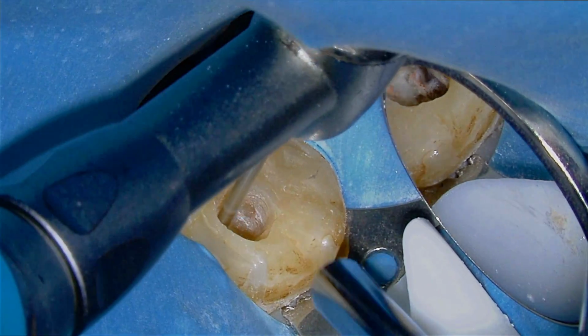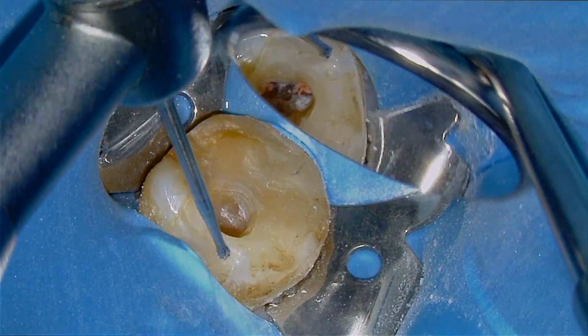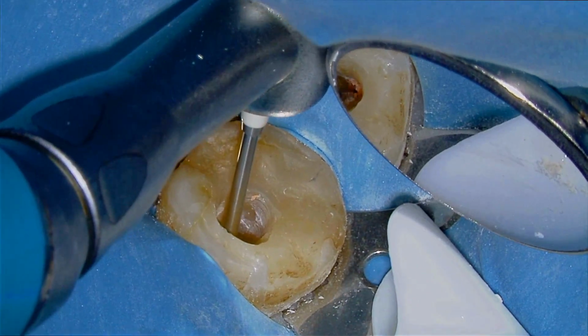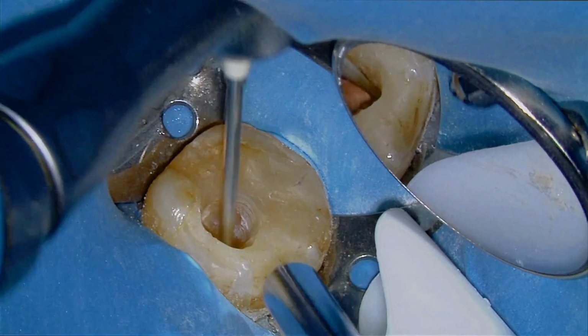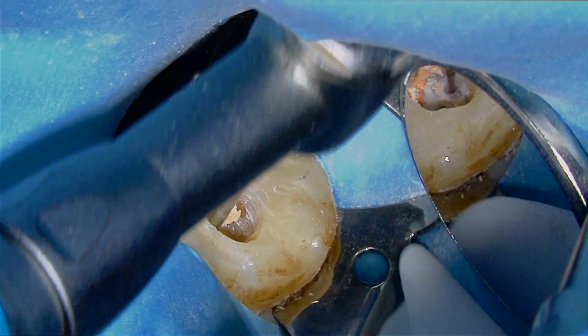You're asking, why didn't you do this the initial step? I'm still asking myself that question as well. So there we go. We've almost got all the composite out of the way, and I'm going to sink that in just to make a little dimple for my Wave 1 Gold primary to get in there and start removing that gutta percha.